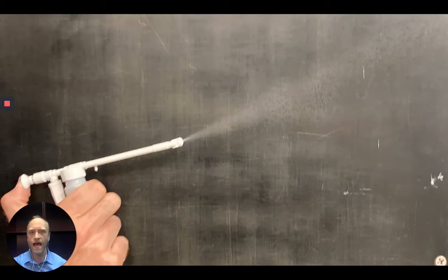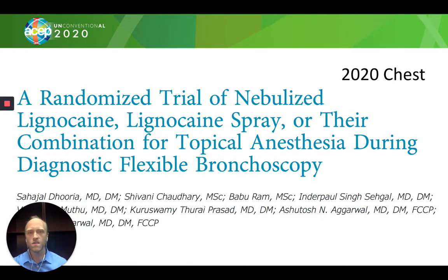Next, you will want to atomize 4% lidocaine. Years ago, when I first started performing awake intubations, I nebulized the lidocaine. However, it is a challenge to get an adequate block with nebulized lidocaine. The patient breathes in a lot of the product into the lower respiratory tract, and a lot of the solution is lost into the environment, so the medication does not go where you need it. Here's a recent publication that found that 4% lidocaine was much more effective than nebulized.